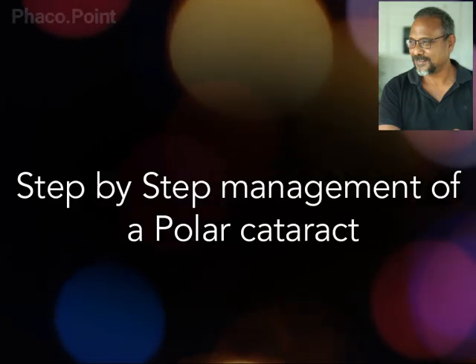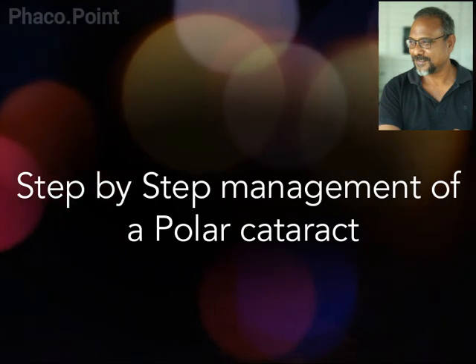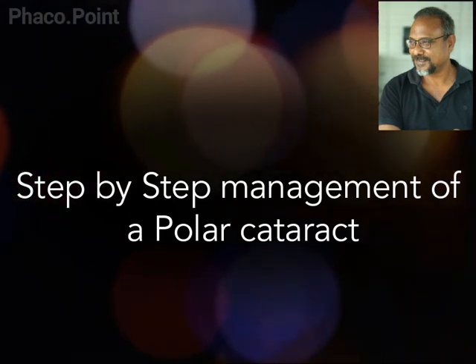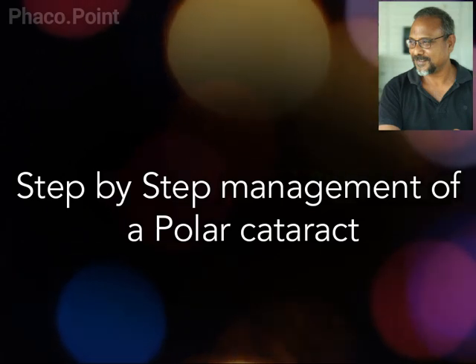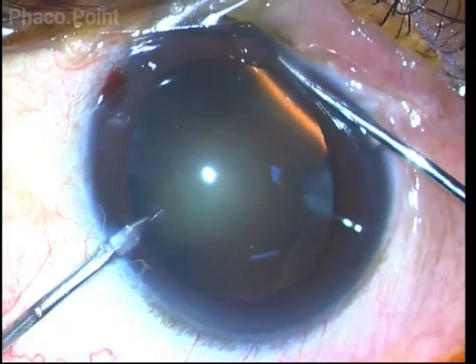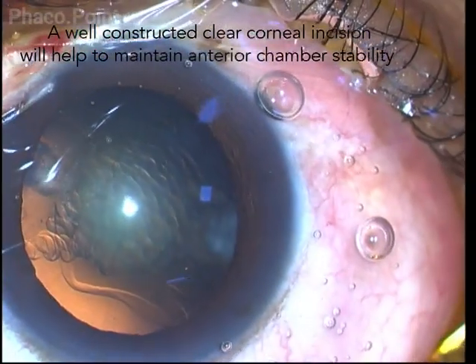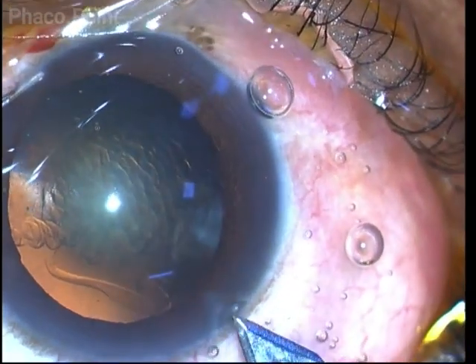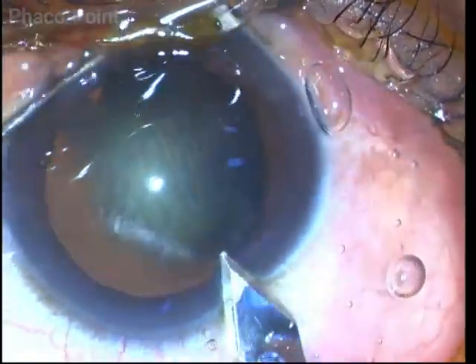Dear friends, we present this video with the intention of highlighting some of the lurking and inherent dangers that one can face in the management of polar cataracts. Let us take it step by step. At the outset, we need to fashion a very good clear corneal incision in order to maintain good chamber stability throughout the phacoemulsification procedure.